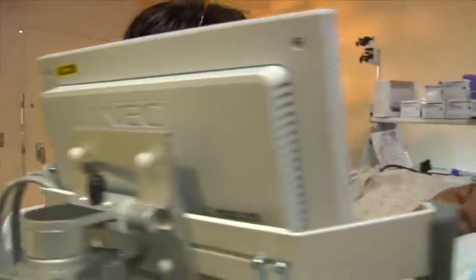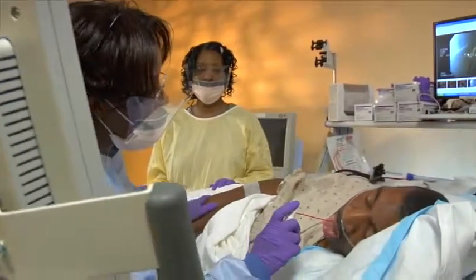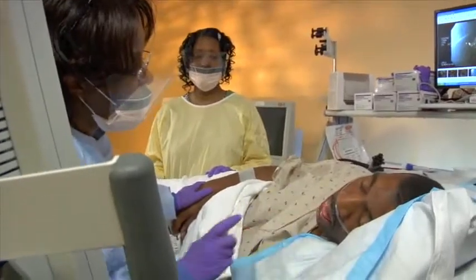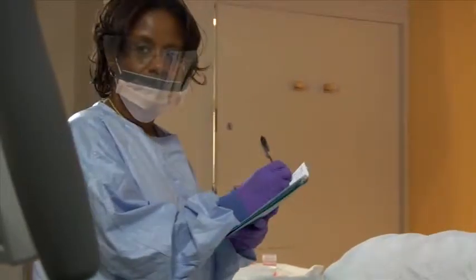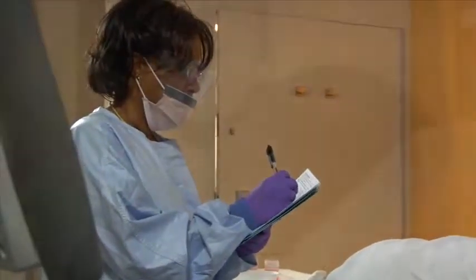During the procedure, everything will be done to help you be as comfortable as possible. Your doctor may give you a sedative. The drug will make you relaxed and drowsy, but you'll remain awake enough to cooperate with your physician. The doctor may spray your throat, or you may be asked to gargle with a numbing agent. This will help keep you comfortable as the endoscope is passed. You should feel little to no pain, and it will not interfere with your breathing. And your blood pressure, your pulse, and the oxygen level in your blood will be carefully monitored.